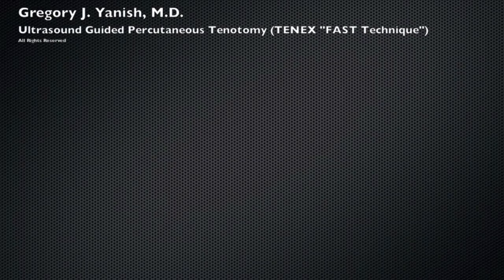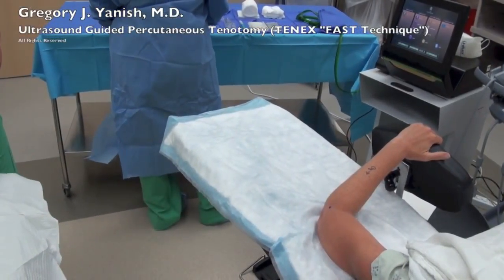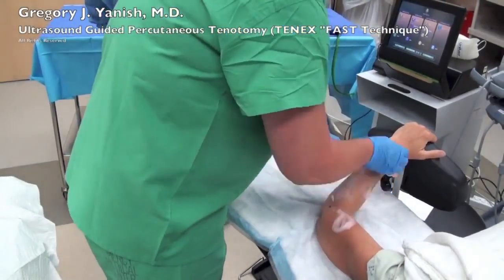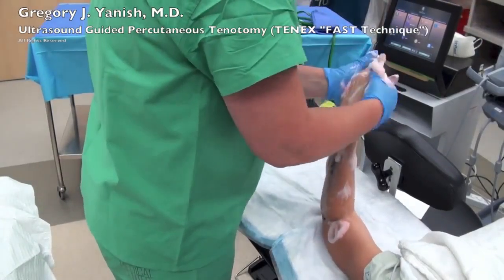Hello, this is Dr. Janisch, and this video is going to be about ultrasound-guided percutaneous tenotomy. In this video, I'm going to be using the Tenex fast technique to remove dead tendon at the level of the lateral epicondyle. This is done for a tear of the common extensor origin or for patients with severe tennis elbow.